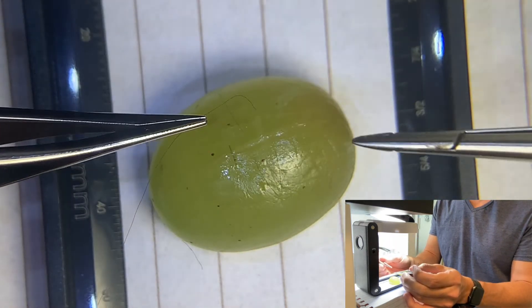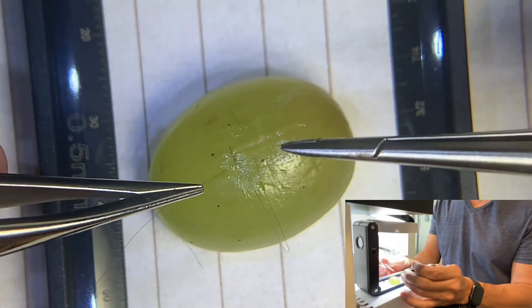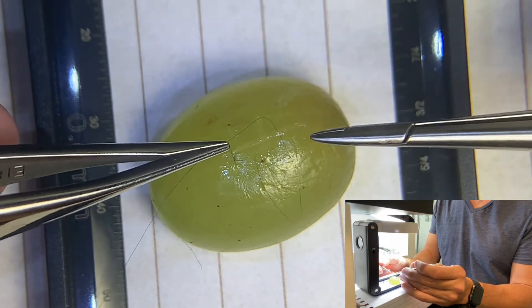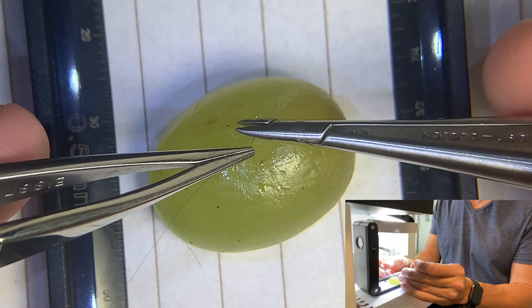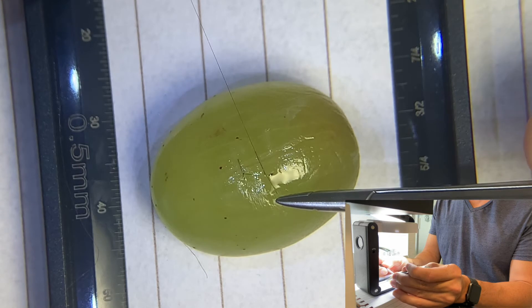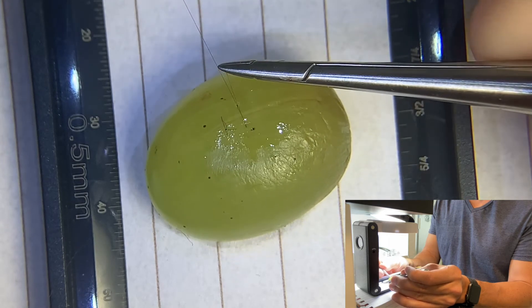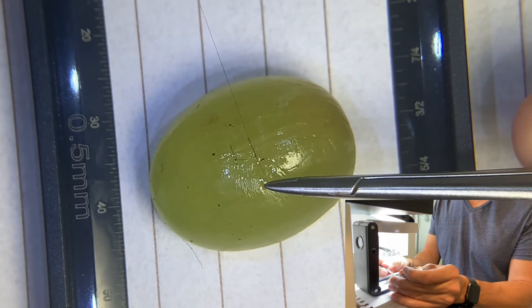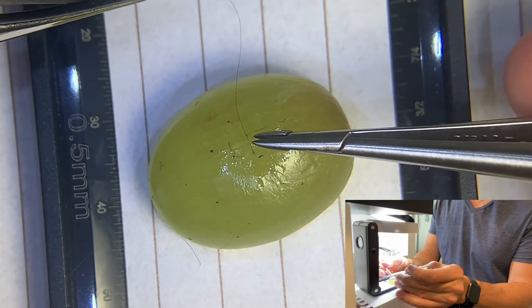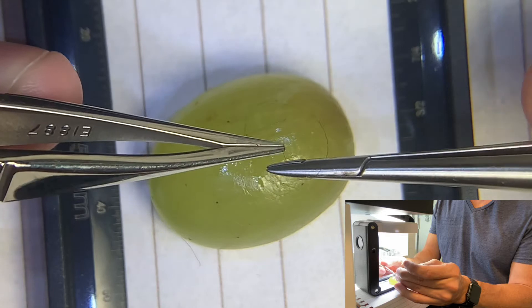When I come back to the wound with both instruments, you can see the first loop's already been made, and it's super big — that's what you want. Give yourself slack. One of the most common errors I see with beginners is giving themselves too little slack. Give yourself a lot of slack — it makes throws around the second instrument easier. Three throws there, pulling it off the needle driver. I've got my three braids. If I wanted to lock it, I could: maintain tension on both sides of the suture and compress the braid — tension on both sides, pull up and over. That compresses the long braid into a dot, which increases friction and holds tension on the wound.